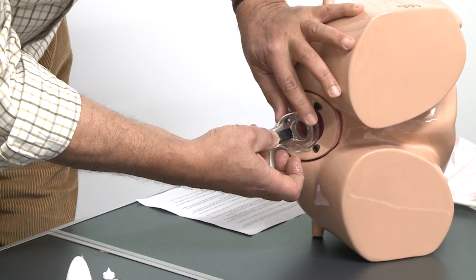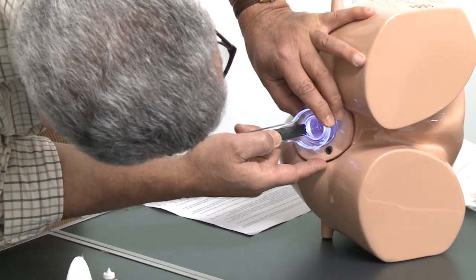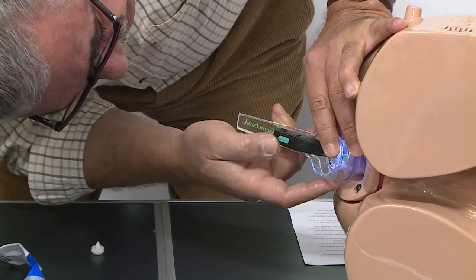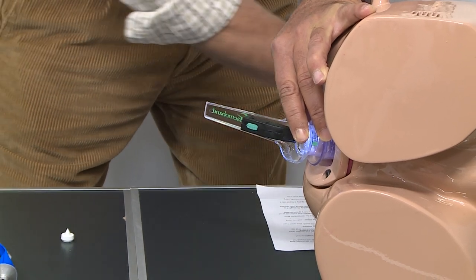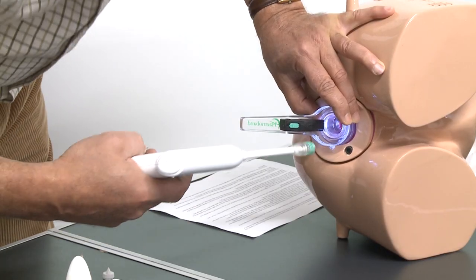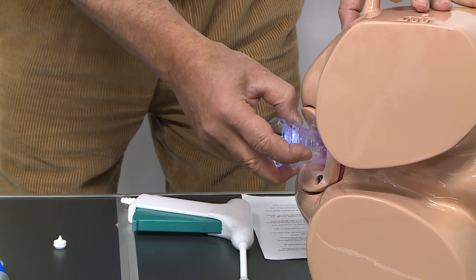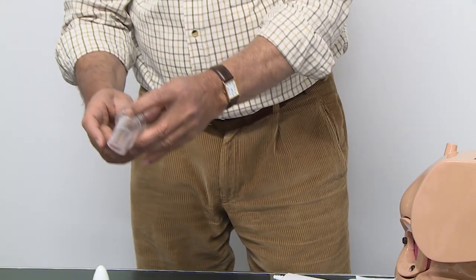We then turn the light on and look inside. Because of the size of the scope, we can see the hemorrhoids clearly. We can steady the scope and sleeve inside, and if we want to do banding we can proceed with that. At the end of the procedure, because it is well lubricated, we very slowly extract the whole scope.